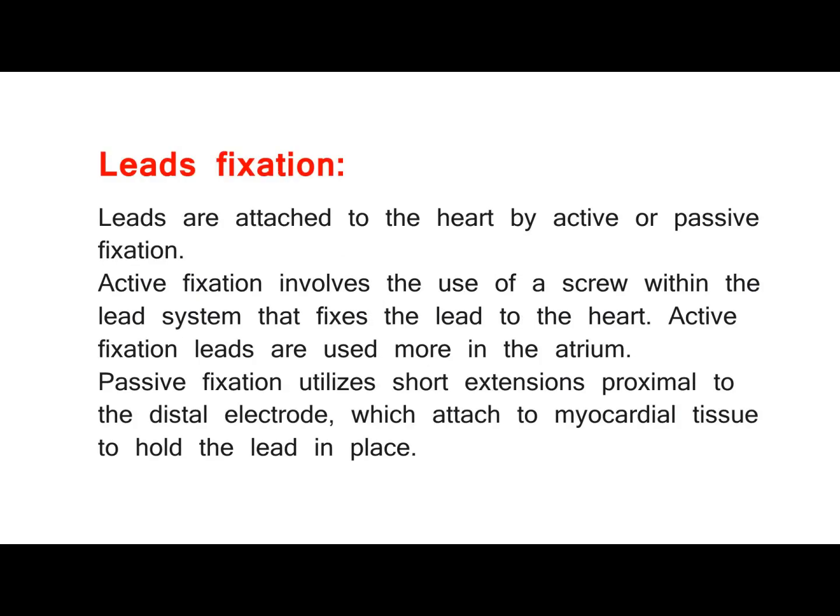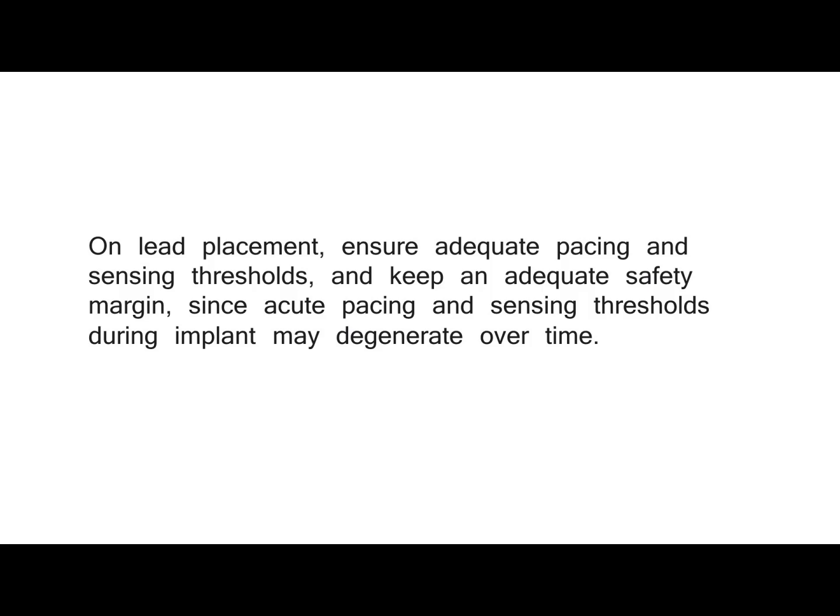Leads fixation. Leads are attached to the heart by active or passive fixation. Active fixation involves the use of a screw within the lead system that fixes the lead to the heart. Active fixation leads are used more in the atrium. Passive fixation utilizes short extensions proximal to the distal electrode, which attach to myocardial tissue to hold the lead in place. On lead placement, ensure adequate pacing and sensing thresholds, and keep an adequate safety margin, since acute pacing and sensing thresholds during implant may degenerate over time.